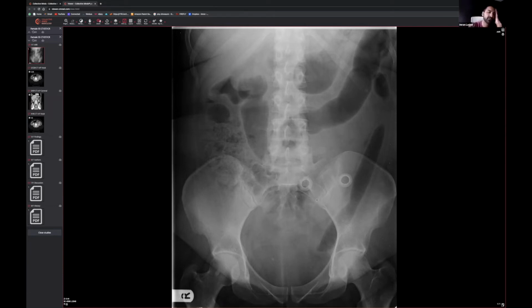And I actually do remember when I was a young gun back in the day, there was someone with abdominal pain and we did the x-ray and I got really stressed out because it looked like they swallowed lots of metallic artifact, and I ran in to quickly examine them and it turned out it was just the belt. So there you go.